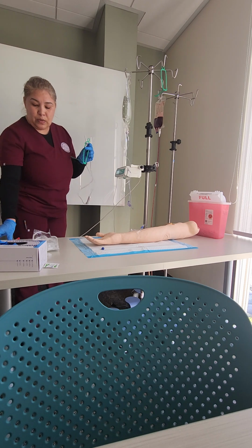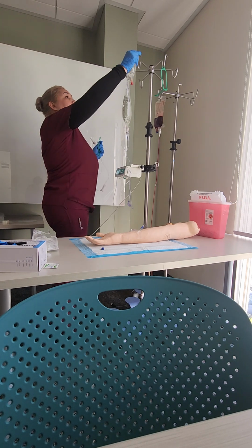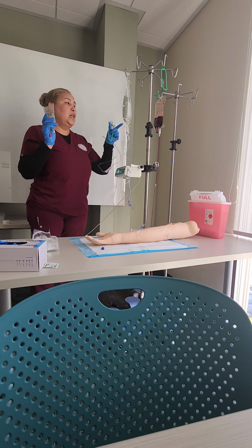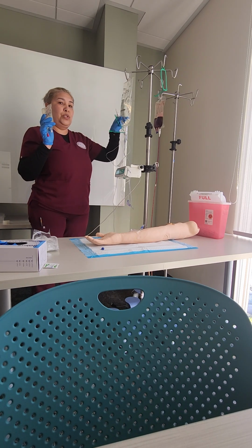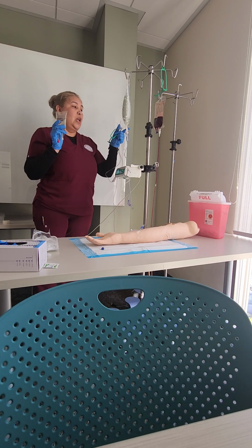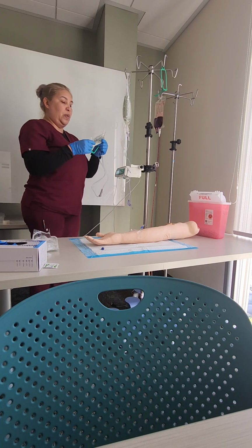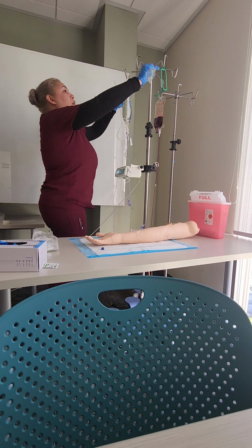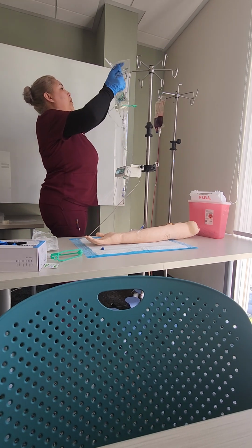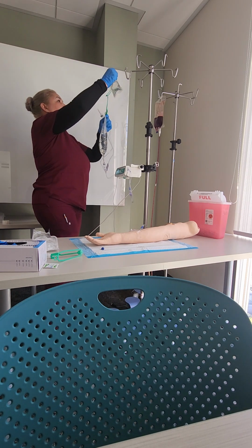So now what I want to do is make my antibiotics stay up in the top. The reason being is because I want this to be infused first, and the hydration solution, the sodium chloride, will be infused right after the antibiotics finish. As I mentioned earlier, we never want to have a line be dry. So what I will do is, oh, there's one already here for me, is hang my bag lower than what I want infused first.